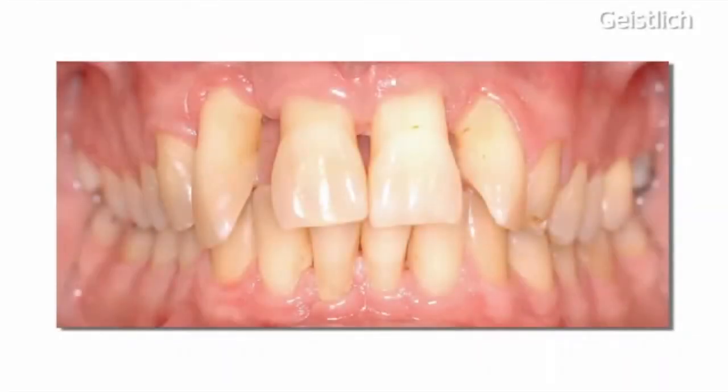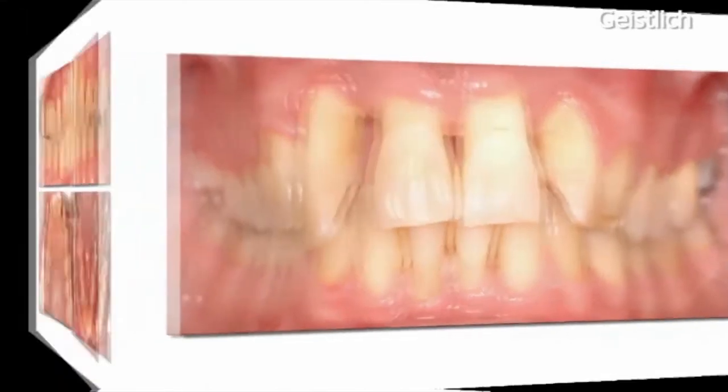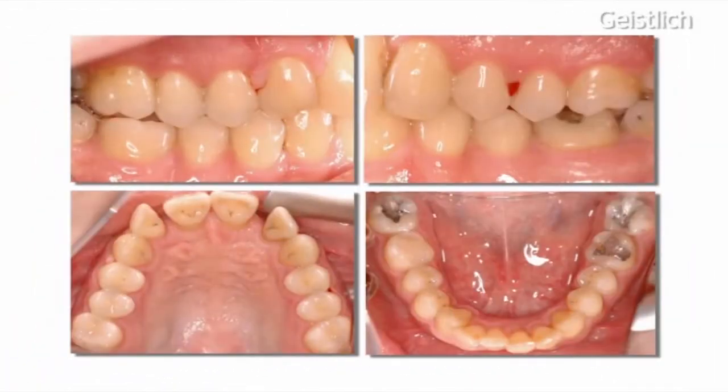This patient is in good general health but suffering from severe periodontitis. He received prophylaxis, including instructions in oral hygiene, scaling and professional tooth cleaning.